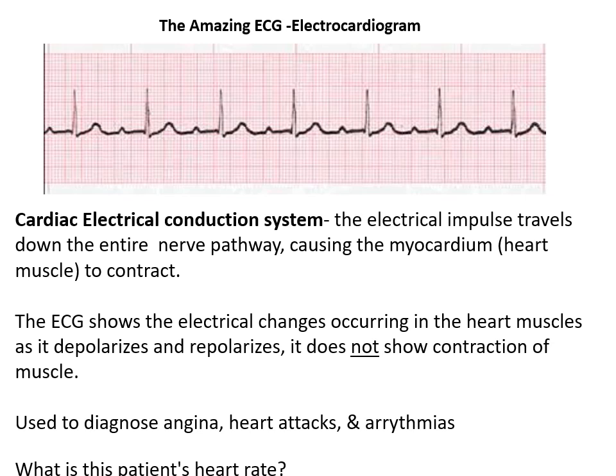And why do we use an ECG? Now, remember, this is just one lead. This is just one strip. So on an ECG, we'll get 12 different views to look at the electrical activity of the heart.